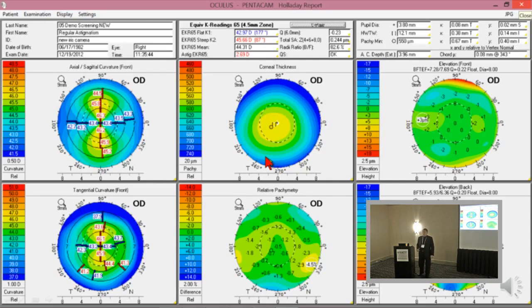Yes? On the EKR, so if we measure on a standard eye, measure the mesopic pupil, say it's 5. We should not adjust 4.5, just leave it alone at this point? Yes, because larger than 4.5 you've got a Stiles-Crawford effect where peripheral rays, even with people with large pupils, doesn't matter that much. All right. In other words, those peripheral rays don't contribute to the image very much. So 4.5 is the largest that you'd ever use. So you may go down, but you'd never go up.